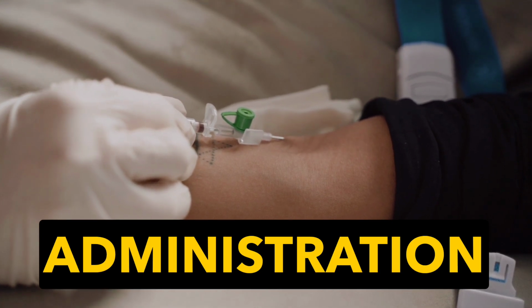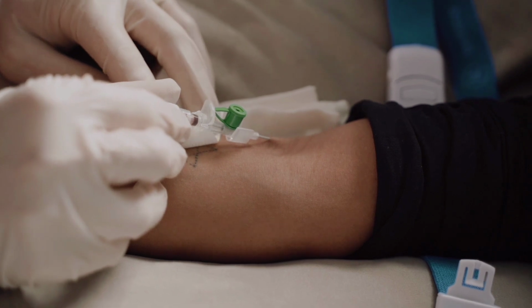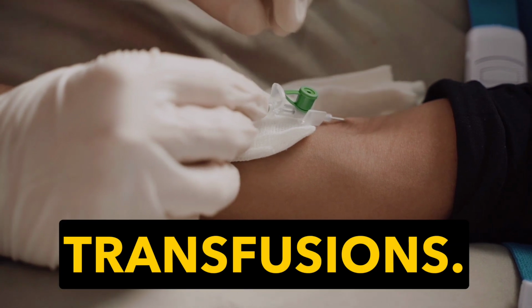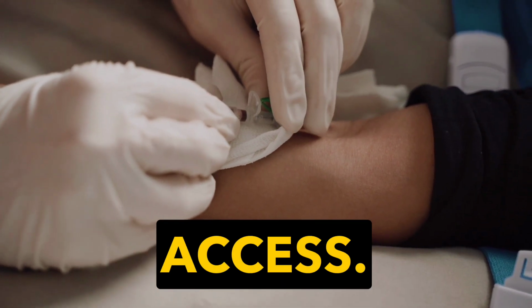Indications: administration of fluids, for example, dehydration, shock. Medication delivery, for example, antibiotics, analgesics. Blood transfusions. Parenteral nutrition. Emergency venous access.